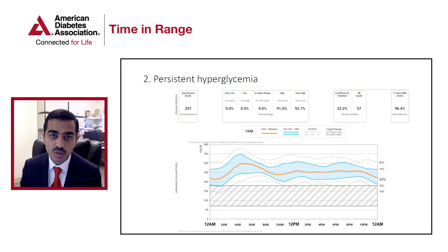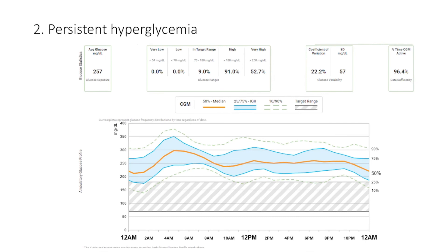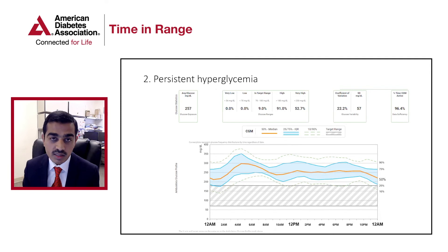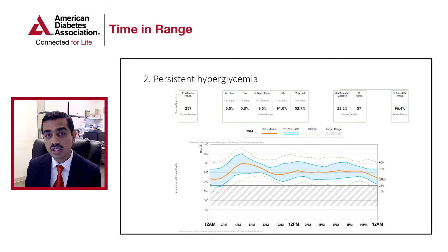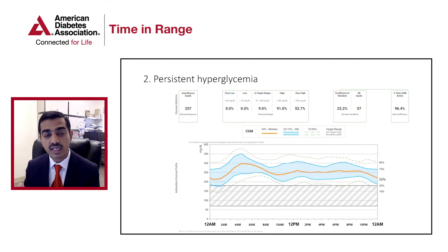The second most common glucose pattern in clinical practice is persistent hyperglycemia. You can see an AGP screenshot of a patient having very high blood sugar throughout the day and night, particularly at night. If you see this pattern, discuss with the patient why they are experiencing such hyperglycemia. There could be several reasons: if it's recently diagnosed type 1 diabetes, maybe denial of disease; the patient may not want to take much insulin; or the patient may have hypoglycemia fear, snacking at bedtime to avoid low blood sugar overnight. In that case, identify this pattern and take appropriate action to resolve the problem.